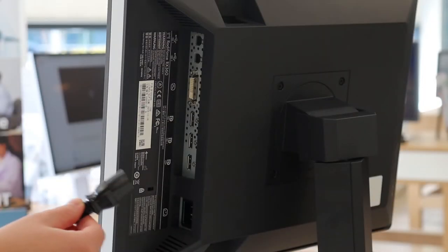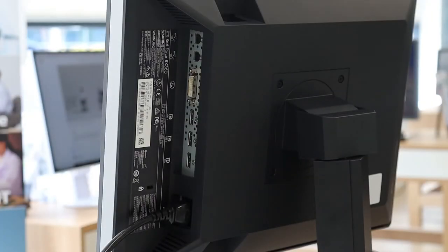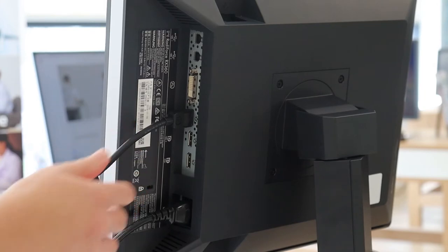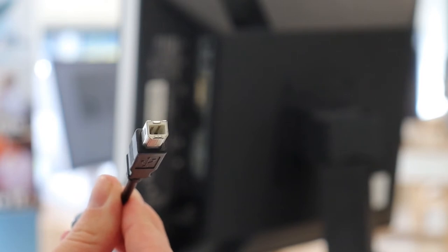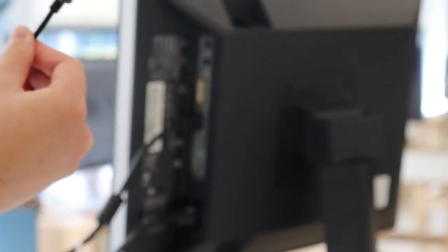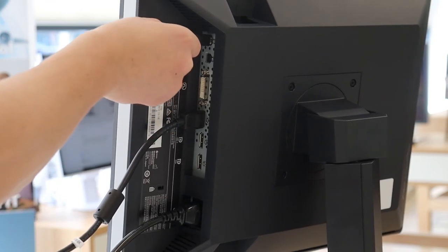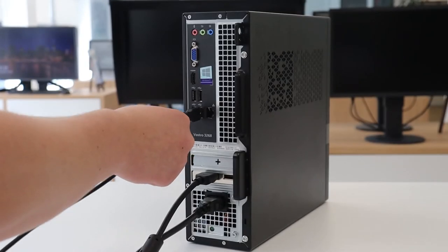First we'll connect the power cord. Using your DisplayPort cable, connect one end into the DisplayPort 1 connector and the other end into your workstation. Finally, with your USB cable, take the B connector end and plug this into the USB 1 upstream connector port, and the Type A connector into the workstation.